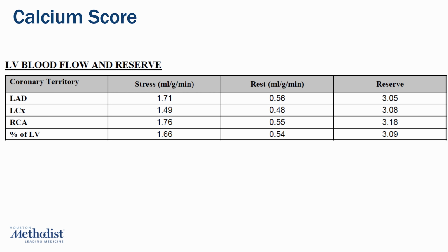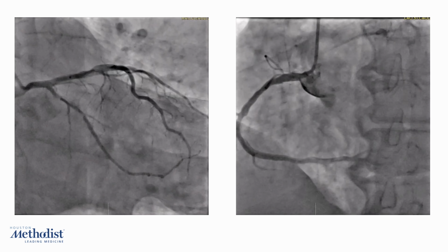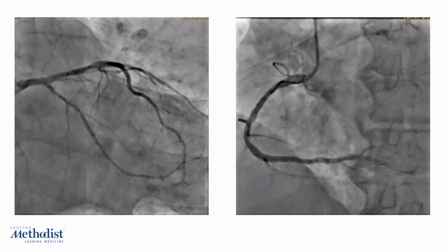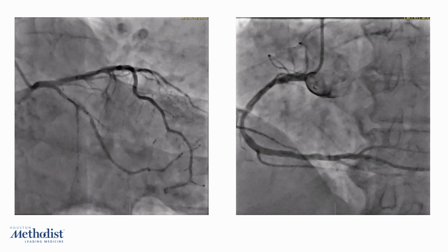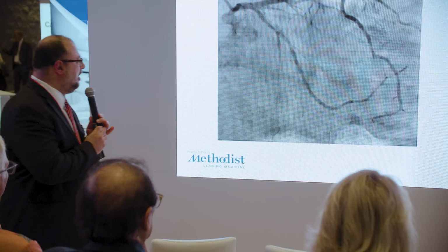So this is a patient with heart failure cardiomyopathy. You can see that the rest flow is to start with reduced, but the peak flow obviously is lower in the area where the patient has the perfusion defect. And when we're looking at this, there is a prior myocardial infarction and there is an ulcerated plaque in this area. And the right has a distal lesion in it too, the PDA. So kind of confirmed that this patient had an infarction primarily related to this hazy lesion that you had in the circumflex.